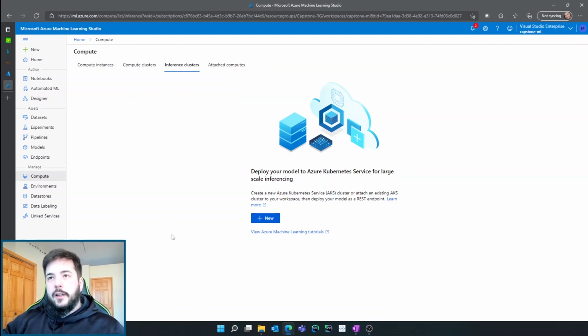So let's say I train my convolutional neural network, I'm happy with the performance, I package that into a saved model file, I deploy an endpoint and upload or send that model file to it. It's now considered an inference endpoint, so it'll have something like a REST API that I can hit, and I can send a new image to that REST API endpoint. It will do something like all of my pre-processing tests and send it to the network, the trained network, for a result, and it may return something like being COVID pneumonia, influenza pneumonia, or otherwise healthy.